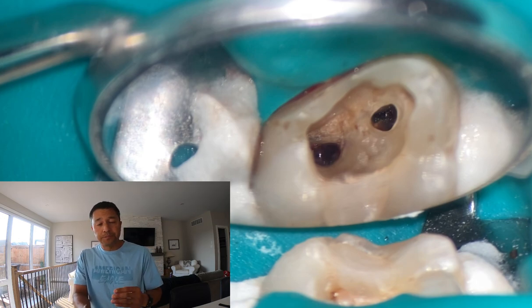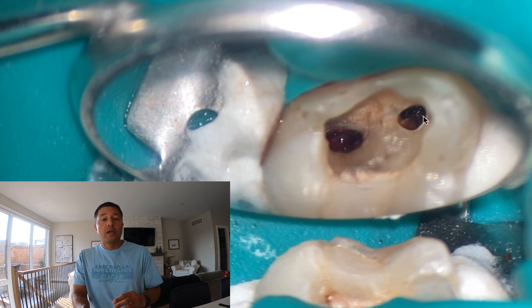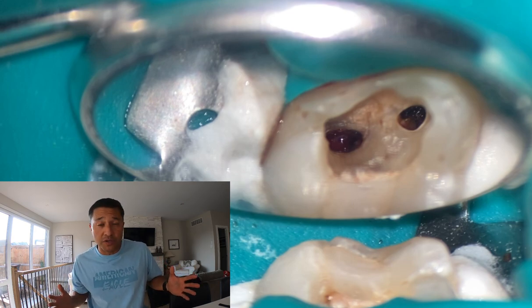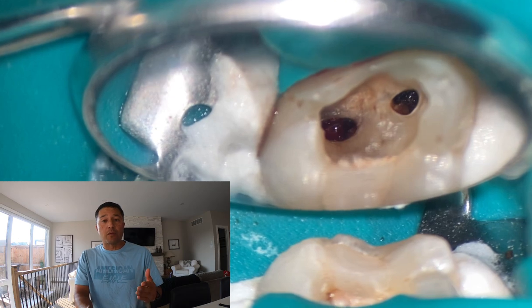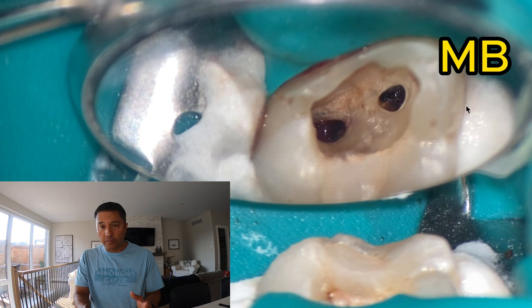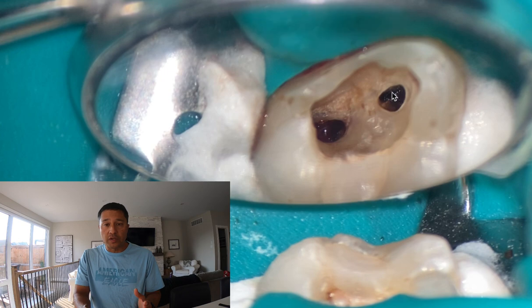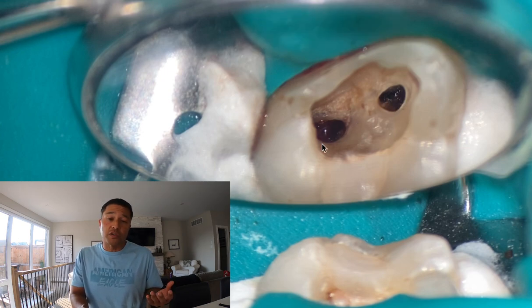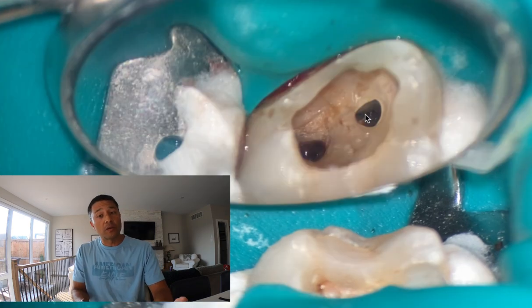Kudos to the student who had this fairly great access and they stopped at the right time. That's probably tip number one of four tips for doing molar root canals: with endo, you can stop at any time. The reason why this student stopped here is because they were afraid of perforating. They hadn't lost their landmarks — you can see we still have the buccal cusp, this is the palatal cusp, here's the mesial wall, this is kind of where MB1 was, and this is palatal. They hadn't lost their way, but they were afraid of perforating.